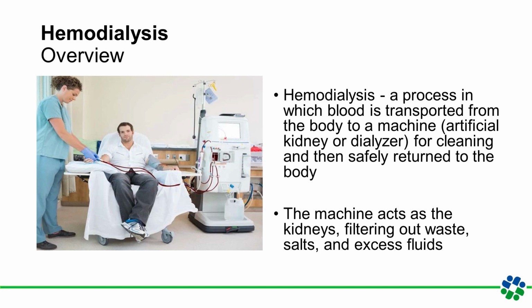And as the blood passes through these membranes, waste materials, excess salt, surplus fluids, they're removed. And this is similar to how the kidneys selectively filter your blood, allowing the vital nutrients to remain while removing harmful substances. Once the blood's been cleaned, it's safely returned to the body.